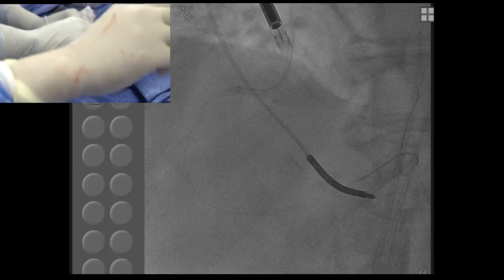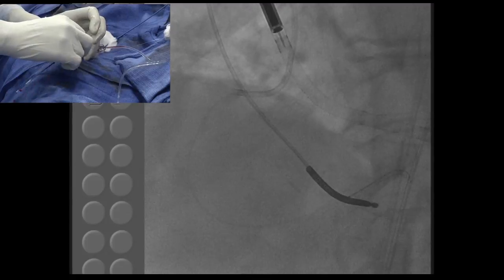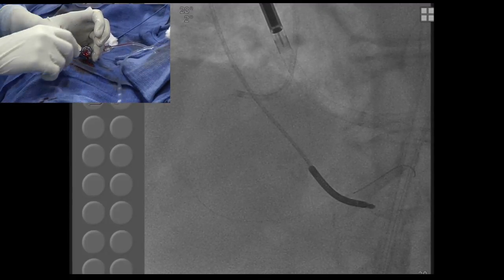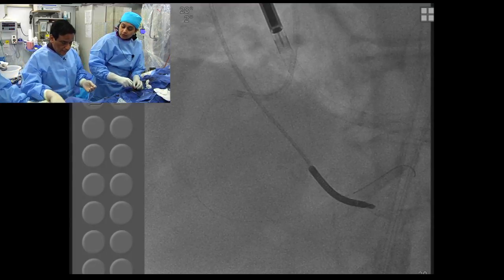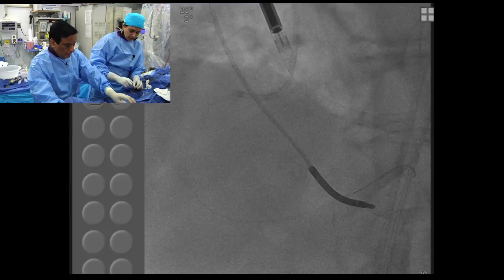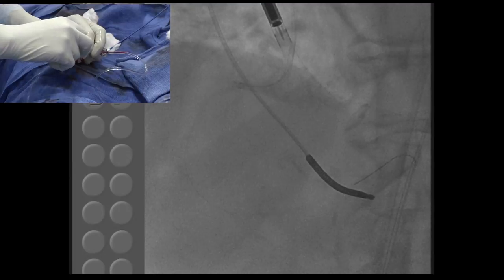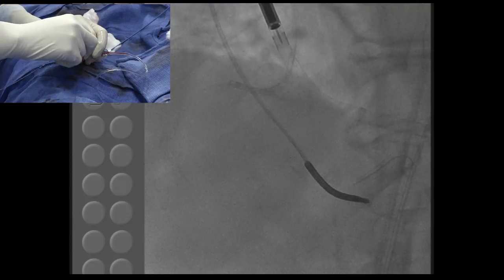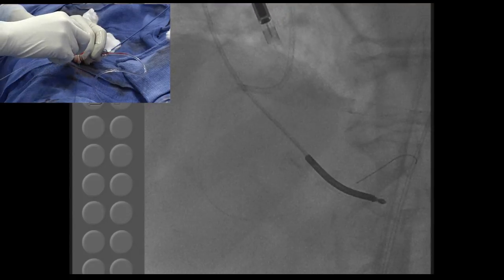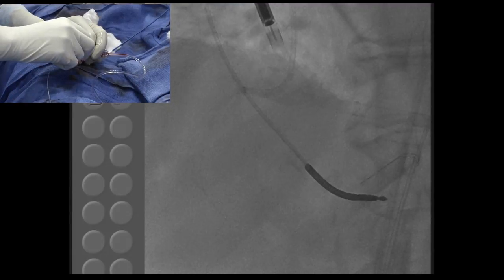So what is your catheter, your stent of choice, the most deliverable, the most trackable stent? Well, after you're done, particularly with the calcific lesion, the stent with the most strength and support. In the majority of my rotational atherectomy cases, we go with the Promus Element.